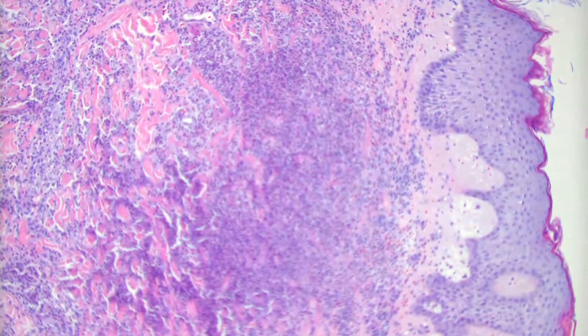You can see sometimes you get abundant neutrophils with the palisaded granulomatous dermatitis and rheumatoid neutrophilic dermatosis. What exactly is the pattern for neutrophils in that? It's more of an interstitial histiocytic infiltrate, but you get quite a bit of neutrophils in there also, which kind of helps distinguish from granuloma annulare.